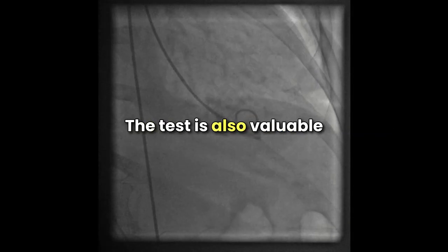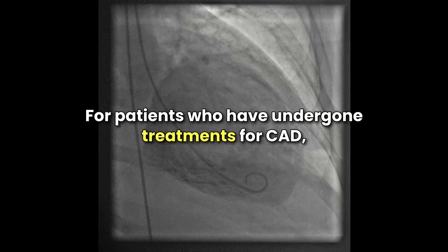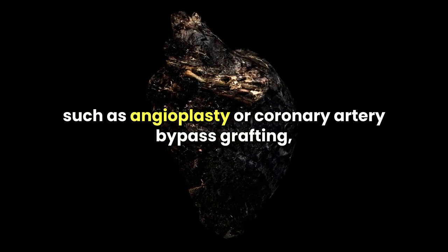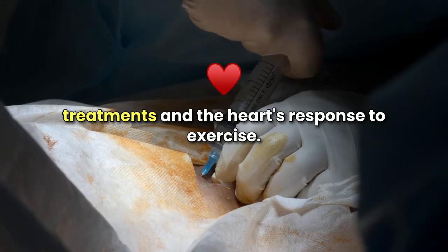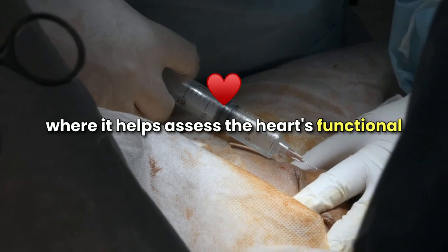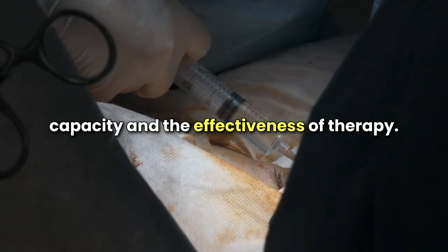The test is also valuable for monitoring response to therapy. For patients who have undergone treatments for CAD, such as angioplasty or coronary artery bypass grafting, stress echocardiography can monitor the effectiveness of these treatments and the heart's response to exercise. It's also useful in managing heart failure, where it helps assess the heart's functional capacity and the effectiveness of therapy.